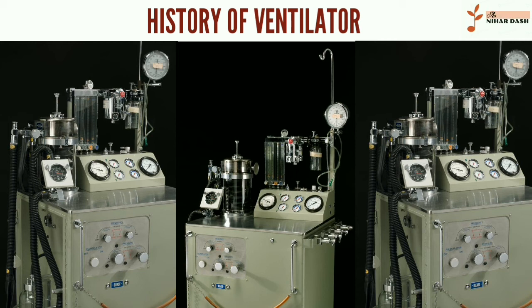Residual pressure after the completion of expiration was also configurable, using a small weighted arm visible to the lower right of the front panel. This was a robust unit, and its availability encouraged the introduction of positive pressure ventilation techniques into mainstream European anesthetic practice.